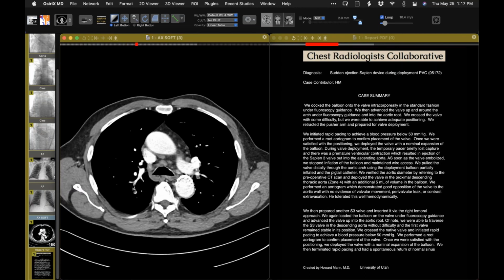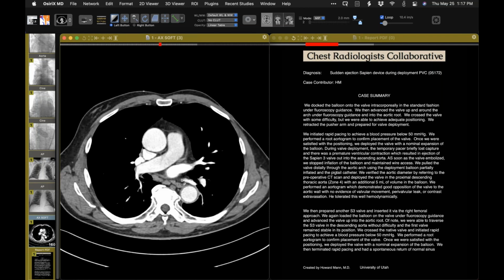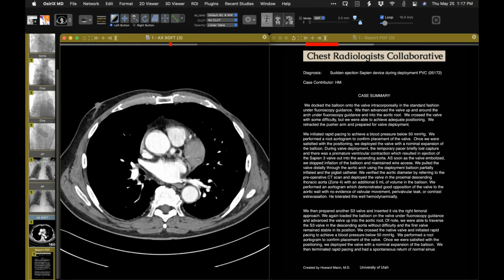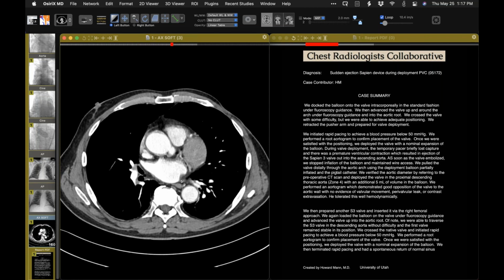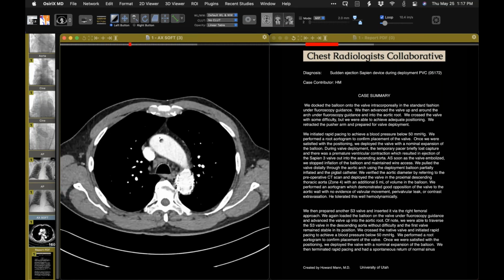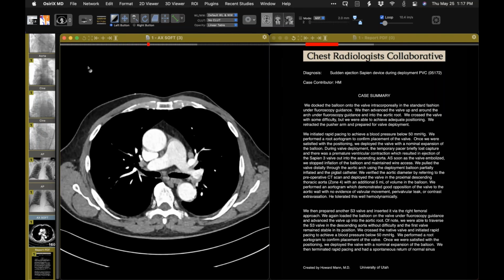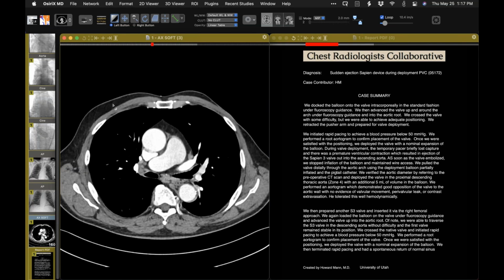Yeah, exactly. So this CT was actually in the context of an oncology follow-up, and a colleague of mine saw that and said, "Hey, wait a minute, something's weird here." And then, of course, we went back and got the history. So interesting. I didn't actually know the details about the rapid ventricular pacing that they do, but now I understand it better.